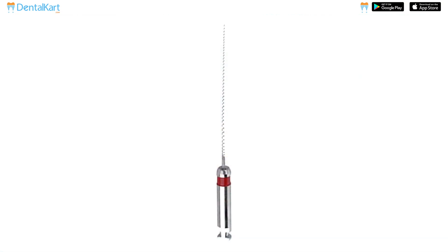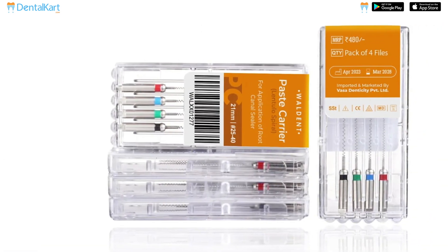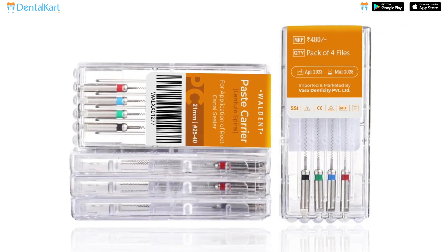Gradually withdraw the paste carrier while simultaneously extruding the filling material into the canal. Once fully removed, clean the instrument thoroughly to remove any debris or remnant of the obturation material. Repeat the process with the Walden Paste Carrier in the other canals to achieve uniform obturation.